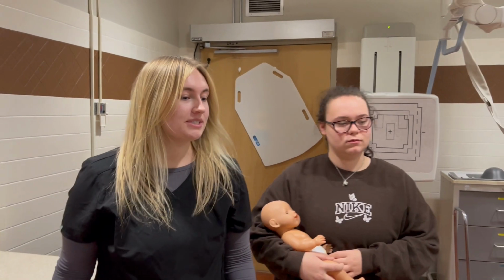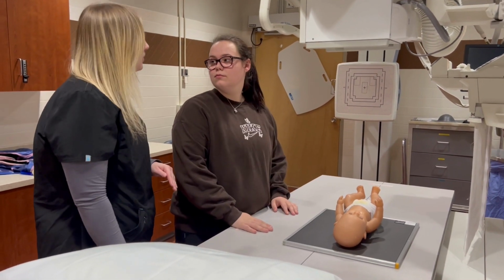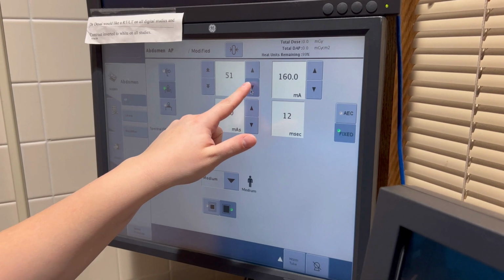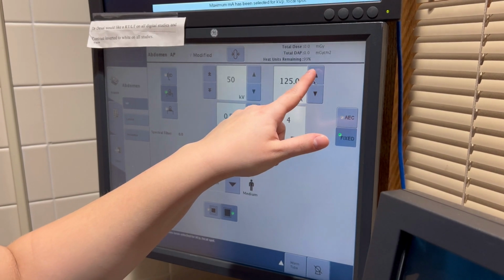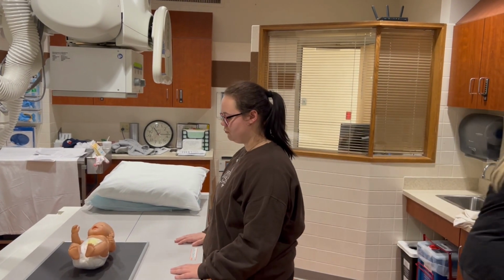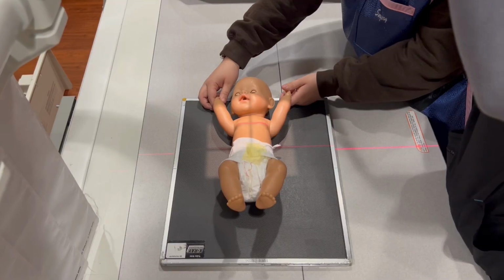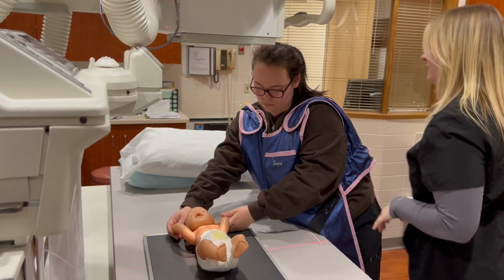All right, Miss Jackson, I'm just gonna have you place him down on the IR. And then I'm just gonna have you wait here while I go set some things up for the exam. All right, I'm gonna give you this lead. I'll have you put it on. And then I'm gonna have you hold his arms up for me. All right, just hold still.